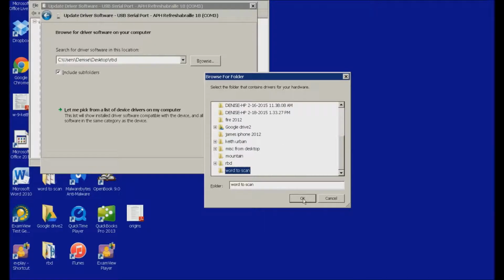Now you need to make sure Desktop is open, so I'm just going to use first-letter navigation. Level 0, Desktop, and there's my desktop. The interesting thing about this is your folders do not come up directly below it. Level 1, Library closed. What I've learned is it comes up all the way at the bottom.